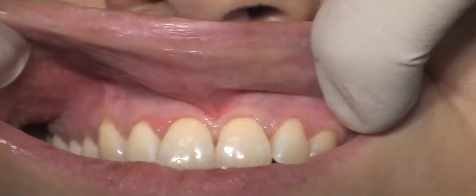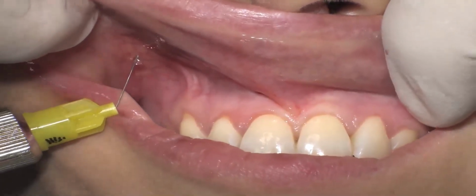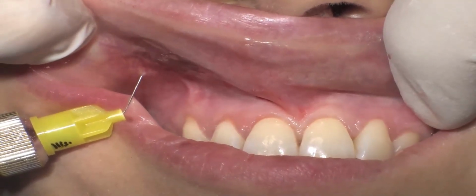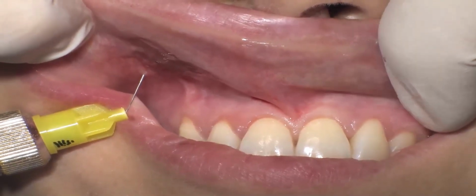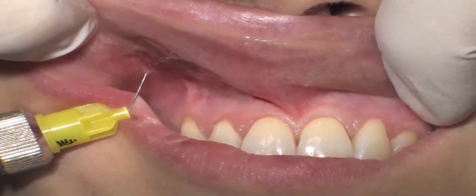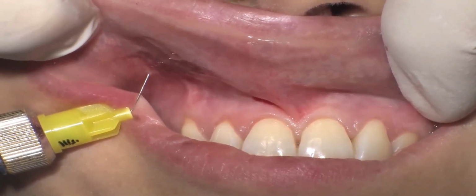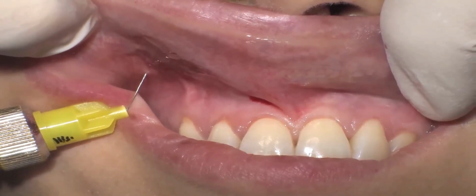And if I have to make anesthesia at the level of the canine, I will make it very, very high, in the alveolar mucosa belonging to the lip, which is not an area that will be included in that portion of the flap covering the root.